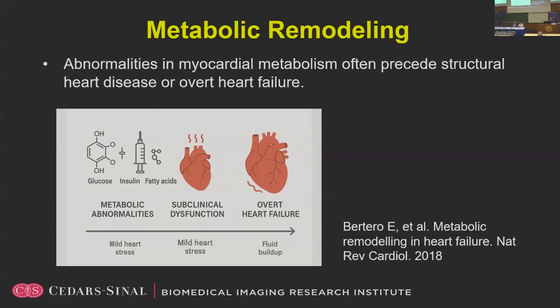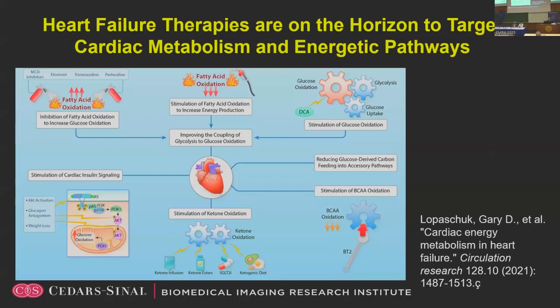So that's why it's very important to look at the metabolism, and there's the potential to use this information to monitor disease progression and treatment response. That's why we want to look into this and come up with ways for MRI to non-invasively measure metabolism. This can also be a biomarker for therapy, exercise, drug treatment, all kinds of things we can do to improve the energetics of the heart.